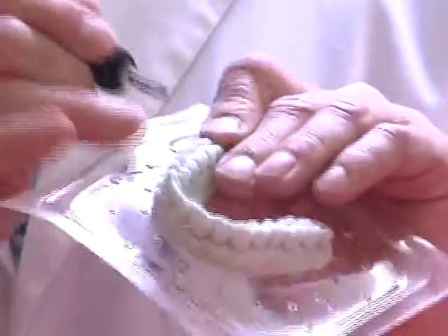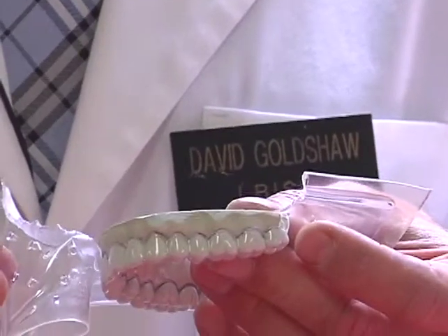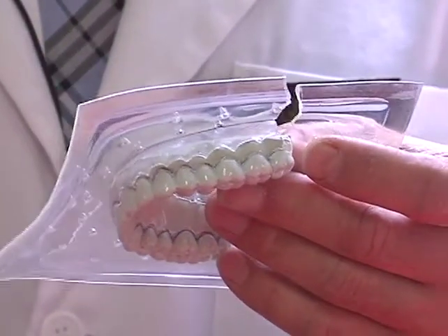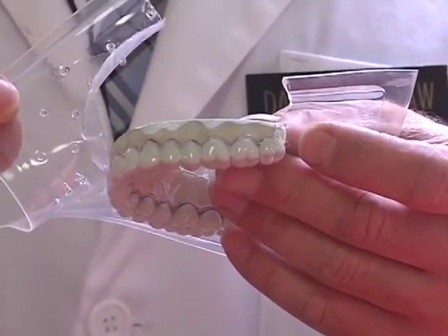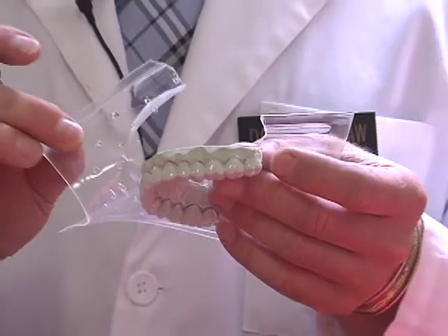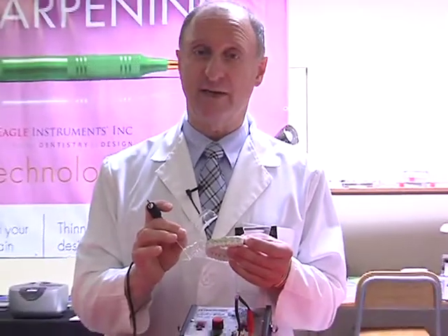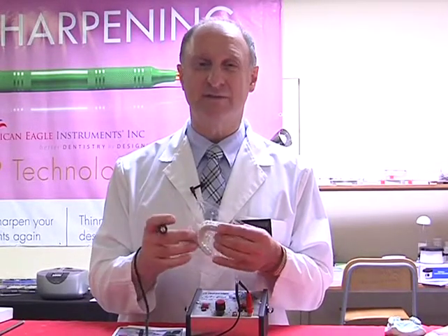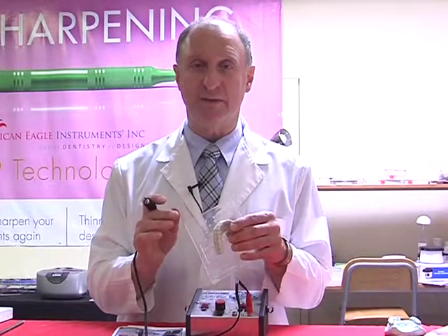So let's just see, I've gone almost halfway through and peel off. This is exactly what we need to look at and see that we've got a nice smooth edge that's reduced itself over. That edge is going to provide a nice, smooth, comfortable fit inside the mouth, but more importantly, something that the patient will feel very comfortable with when their tongue is over the surface. So not something that's going to interfere. I'll finish trimming this up and we'll come back in just a moment.